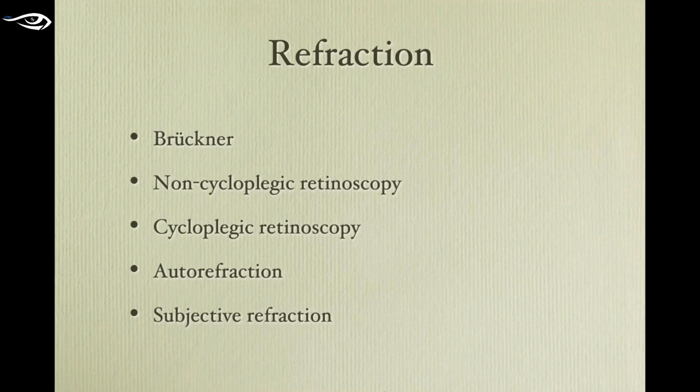She did the research on the Mohindra infant retinoscopy technique while I was a student. It turned out that studies done subsequently have shown it's not a very accurate test. It gives you some information, but it's not all it's cracked up to be. In the US, there have been a couple of really solid studies that have shown that it's not a very good test.